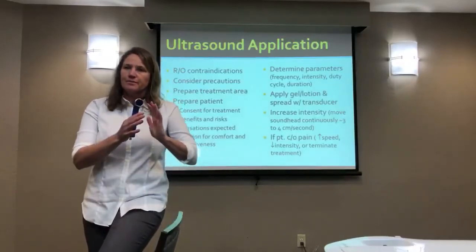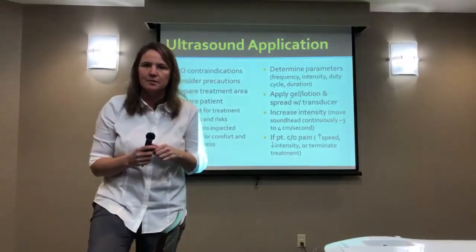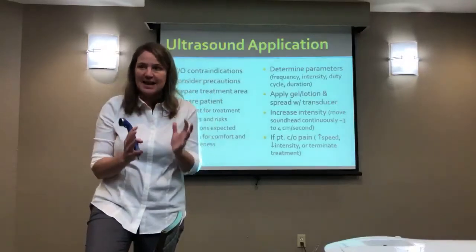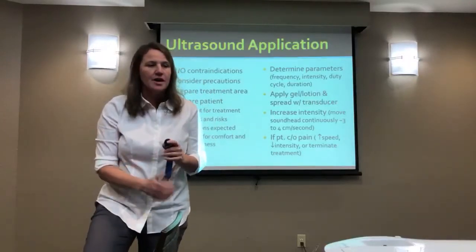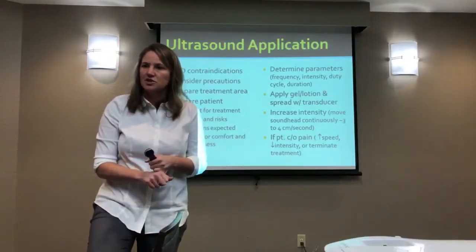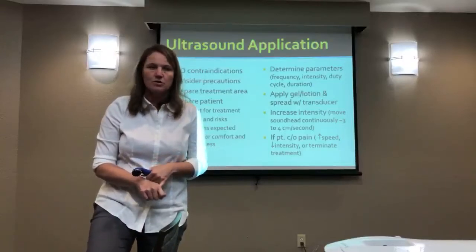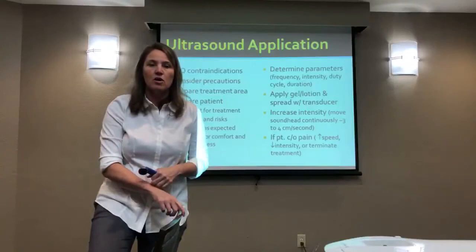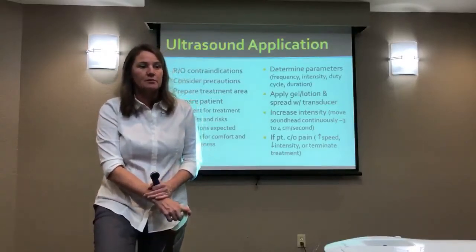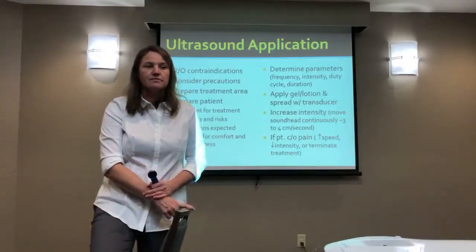Okay, so what I want to do is, because in the lab environment, when we go back there and do labs, just like yesterday with the E-STEM, it was more of a fun thing, we're not going to necessarily simulate an exact patient care scenario. But if you are going to do an ultrasound on a patient, always rule out contraindications, really every time. PTAs, COTAs, always think about them. Each one of us is our own checks and balances, helping each other out. So think about any contraindications, any precautions.